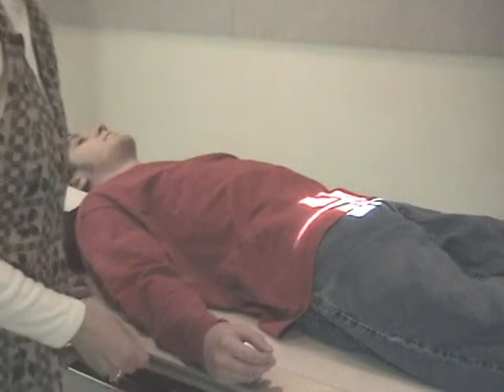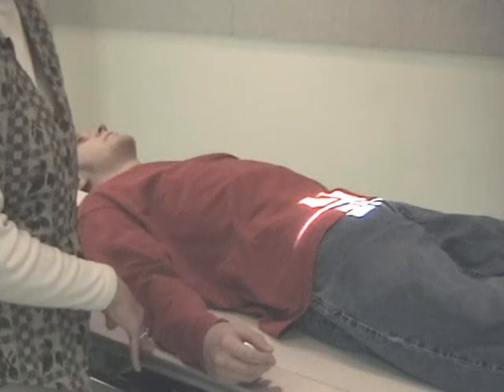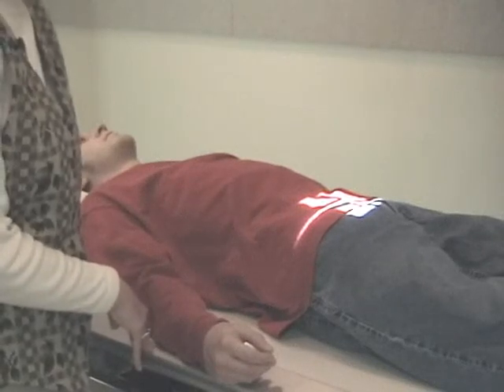If you have difficulty remembering the amount of tube angle that you need, a student trick is they've come up with 15 towards the face. The patient's face, 15 degrees. That would be for the sacrum.